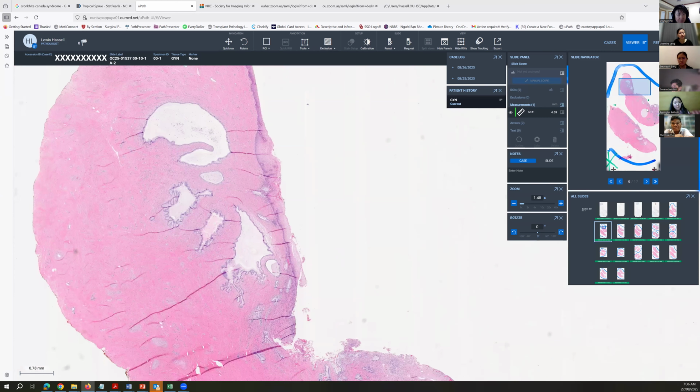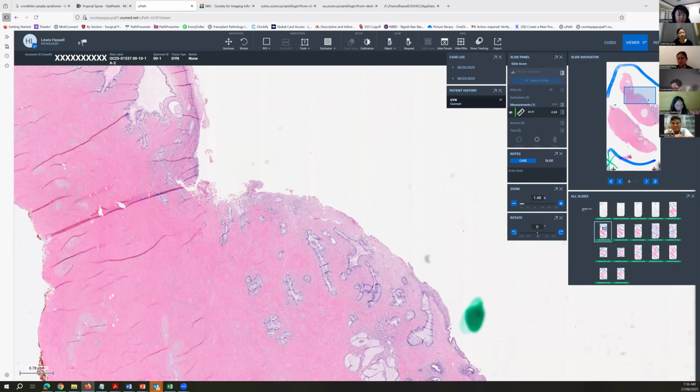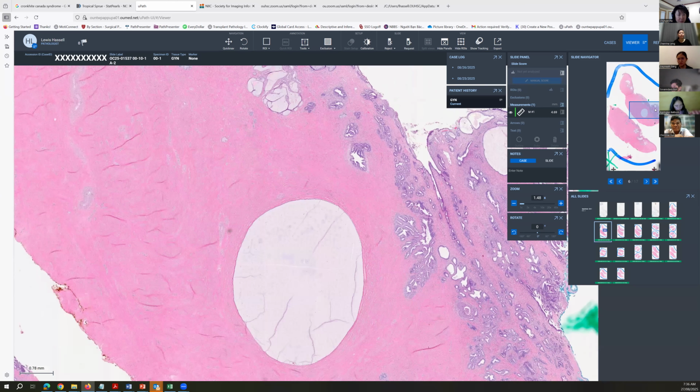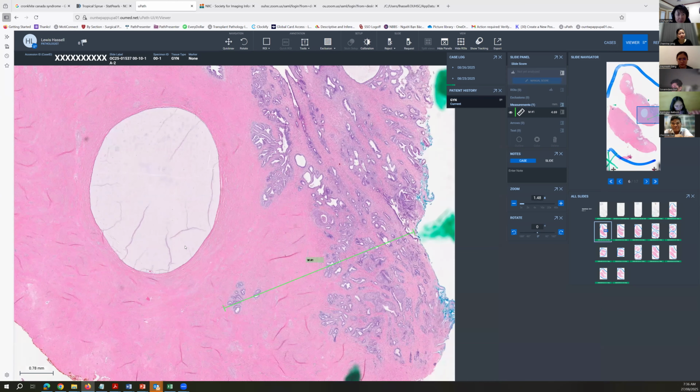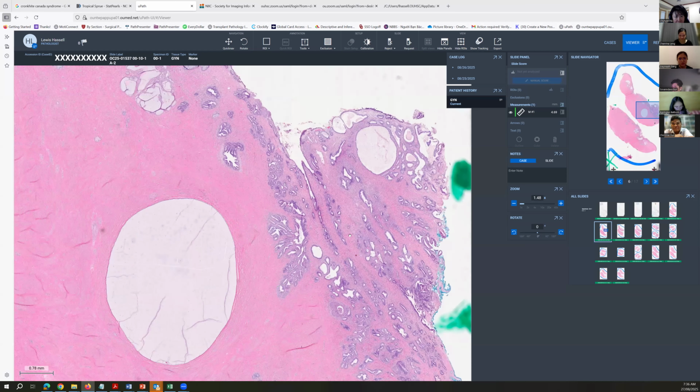And here at the other end is the endocervical aspect. And here it looks a bit different. It looks kind of busy. We have a benign cystic structure here in the middle. And then we have, as you can see here, some darker hyperchromatic tissues here.